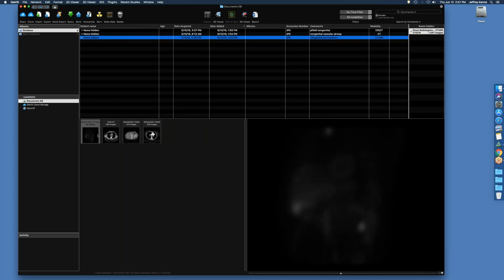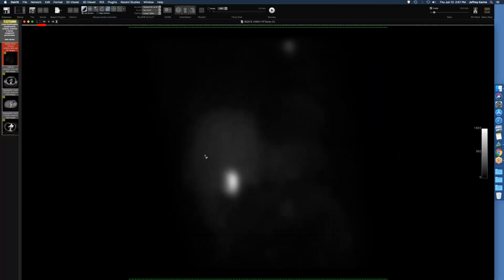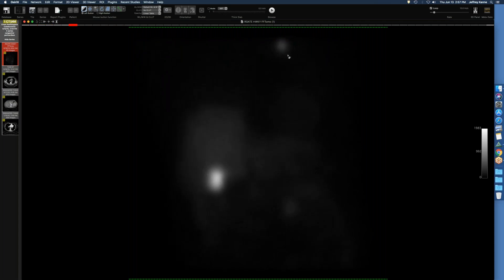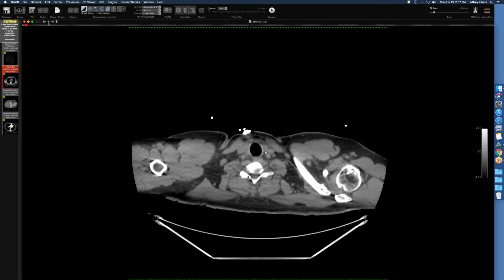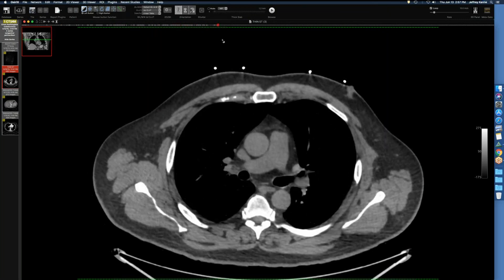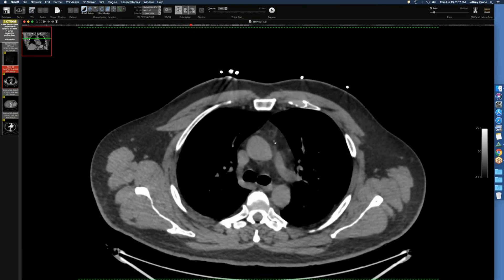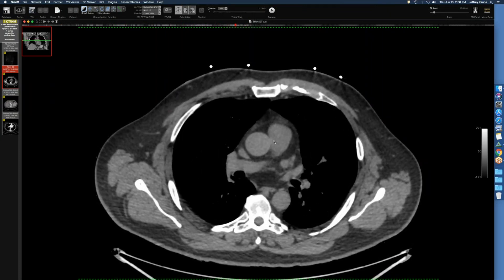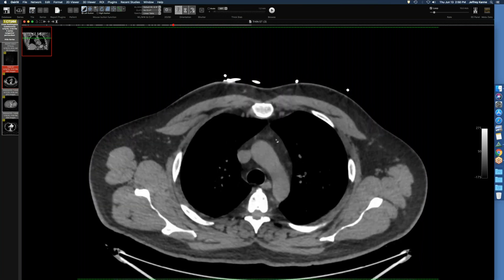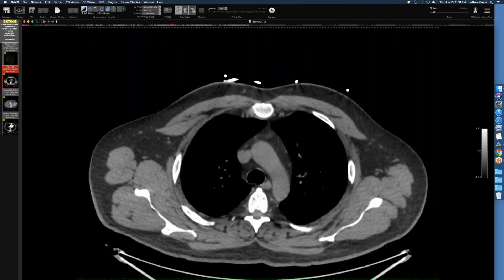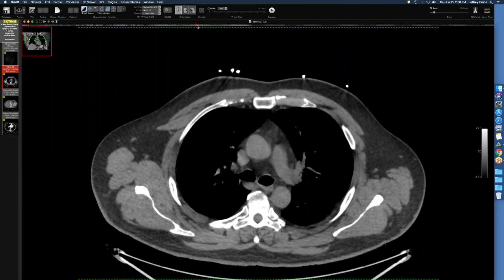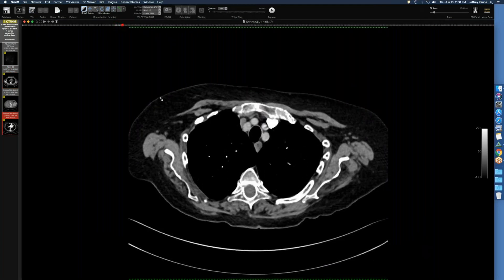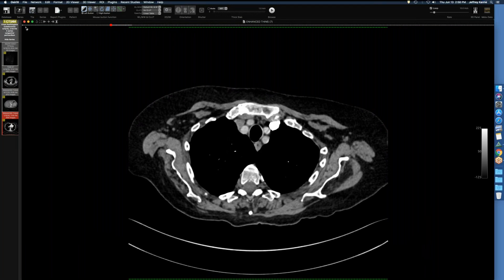This different case: the patient had a cardiac sestamibi scan and there was uptake noted in the upper chest on the raw images. A CT scan shows a little bit of thymic tissue in that area correlating with the uptake. There are reports of sestamibi uptake in thymic cysts, thymomas, and one case was a false positive for a parathyroid adenoma that turned out to be just thymic tissue.